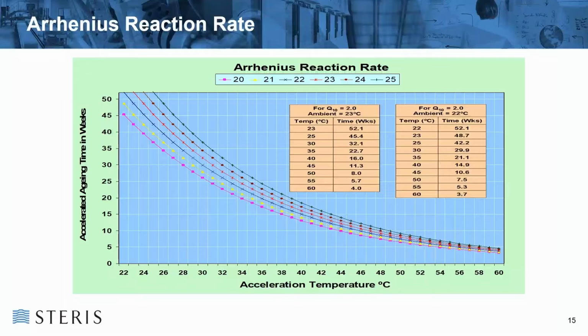Typically, what's used is in or around 50 to 55 degrees for most studies, because you're getting towards the edge of the upper level of 60 degrees, which is not favored by the regulatory bodies, because the standard basically states that above 60 degrees the aging factor becomes non-linear. Okay. If you have a drug-coated product, you will need to be in around 38 to 48 degrees. Again, that will depend on the product that's coated onto it and how the temperature will affect the efficacy of that product.